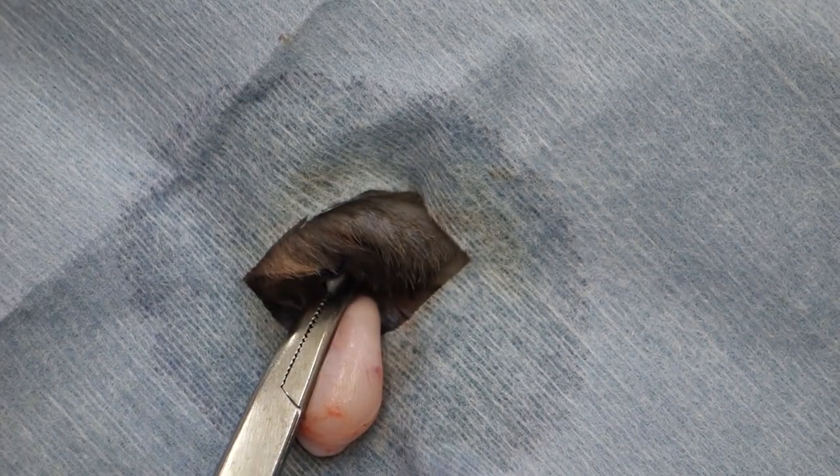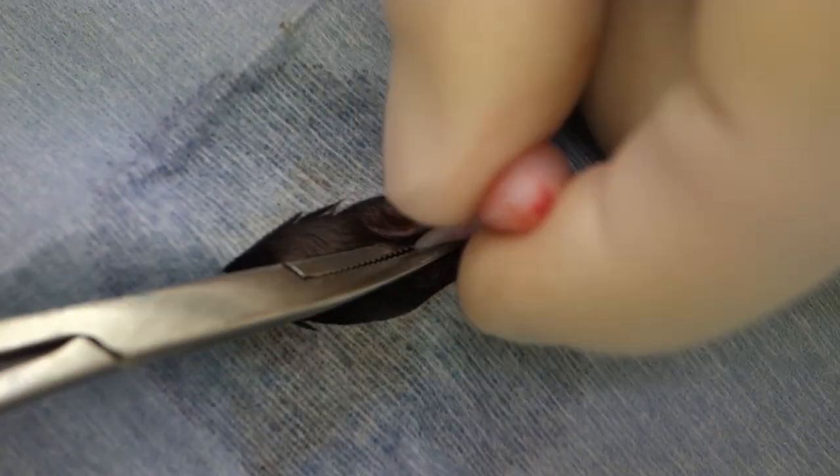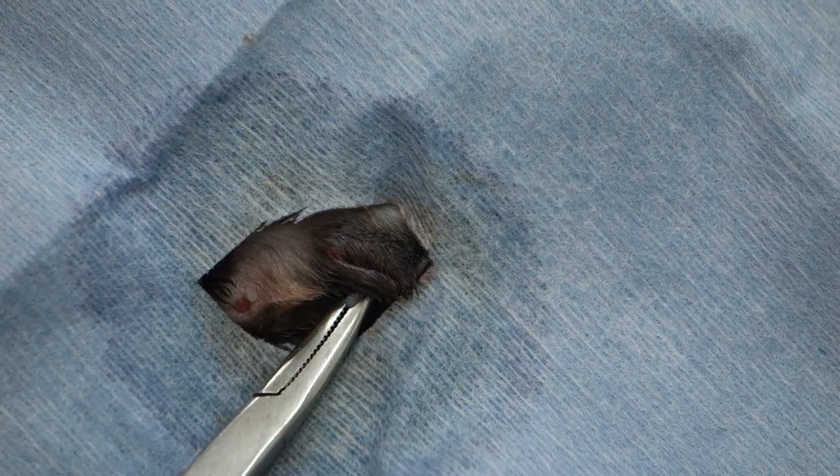We cut the suture material and use our scalpel blade to remove the testicle. We then check for hemorrhage from the end of the spermatic cord before we replace it into the scrotum.